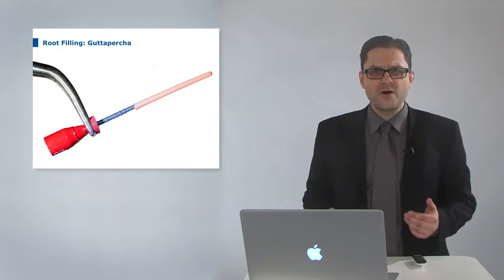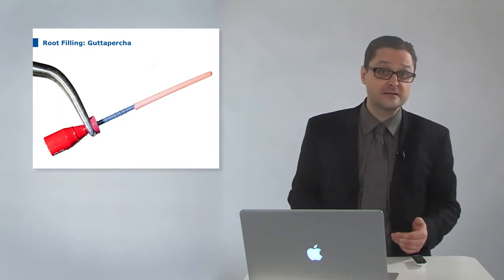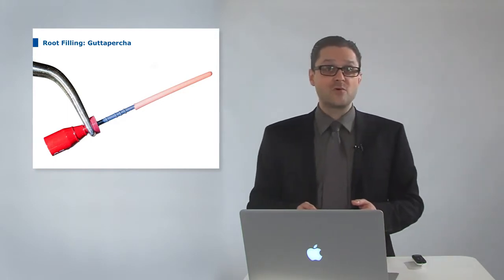But it is not possible to remove all bacteria in the inner tooth. That's why a root filling is finally performed. The living environment of the bacteria is taken with the filler gutta percha. These are conical caoutchouc points in different sizes. Here you can see a modern thermoplastic filler.